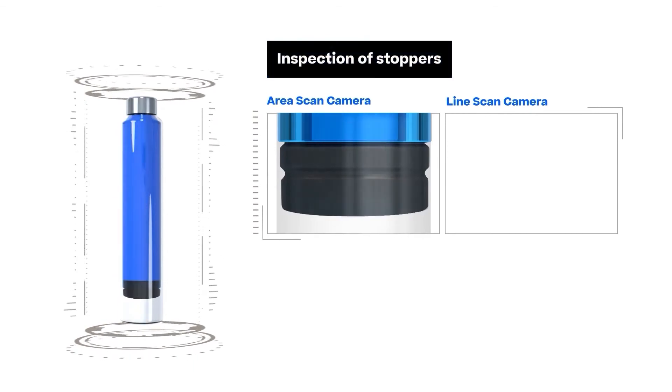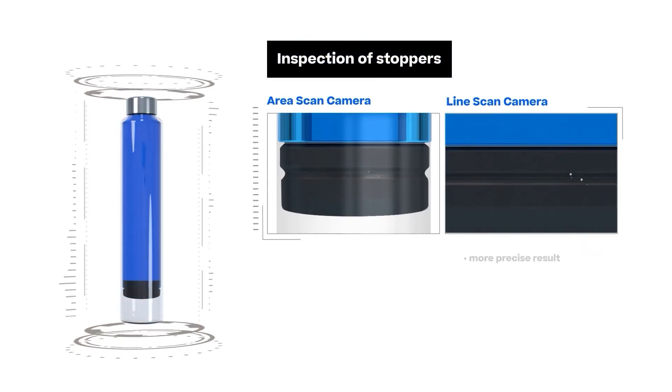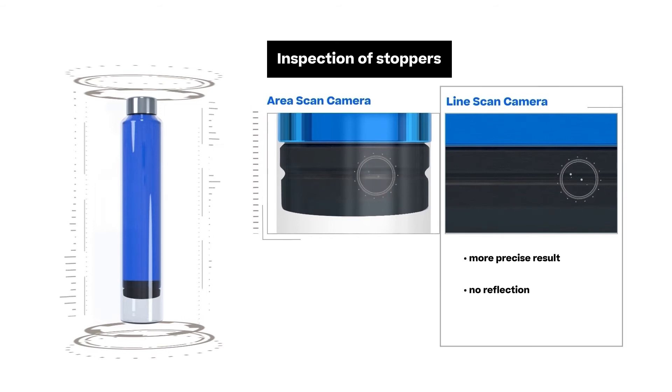When inspecting the stopper area of cartridges, for example, the results of a line scan camera are usually more precise. In addition, homogeneous illumination and a fixed camera angle prevent reflections and minimize false rejections.